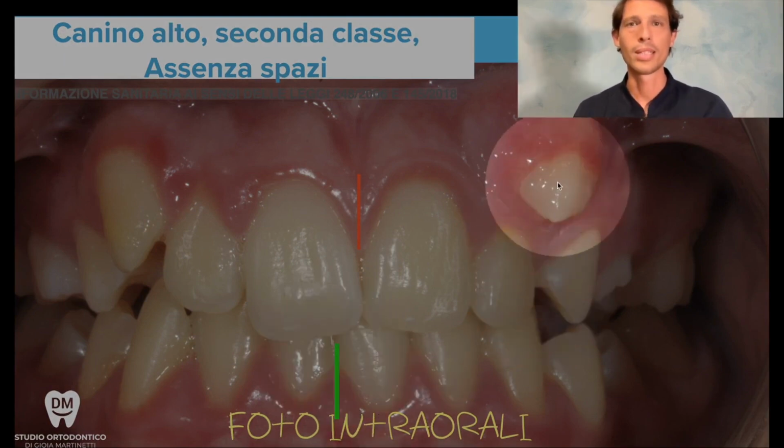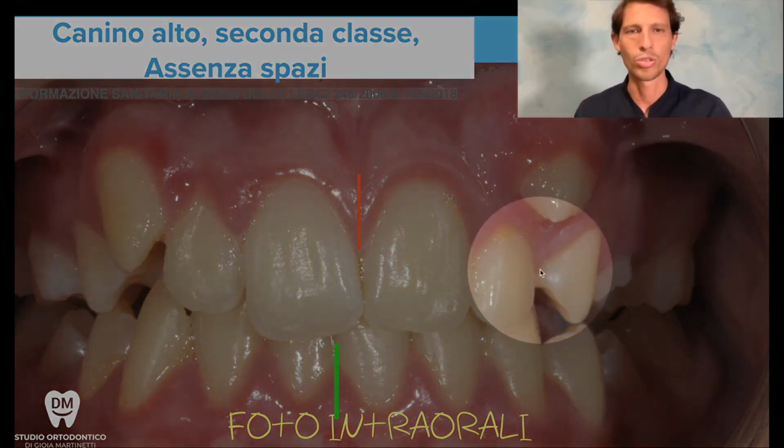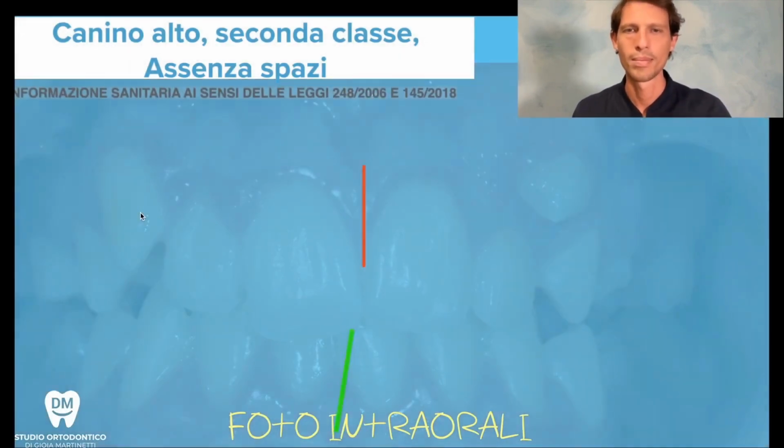At the top left, there's a canine that is completely out since it doesn't have any space. There's no space for it to come out. And also on the right side, there isn't much space either. But there's a little more space there. This canine doesn't know where to come out, so it has come out a bit, but not completely.